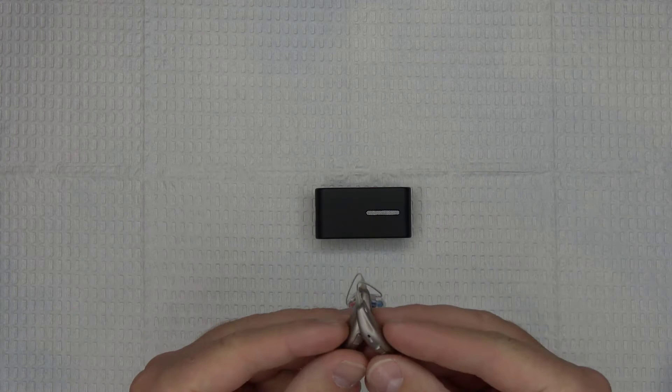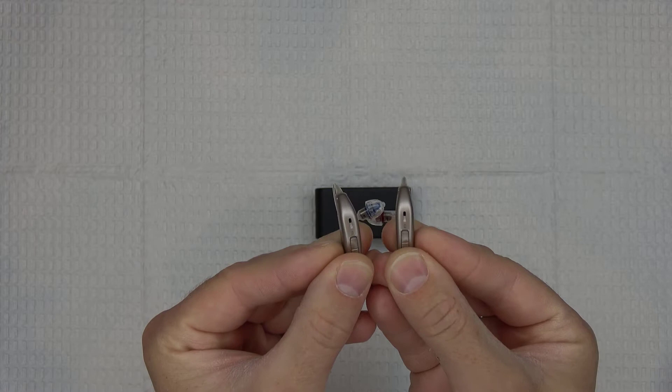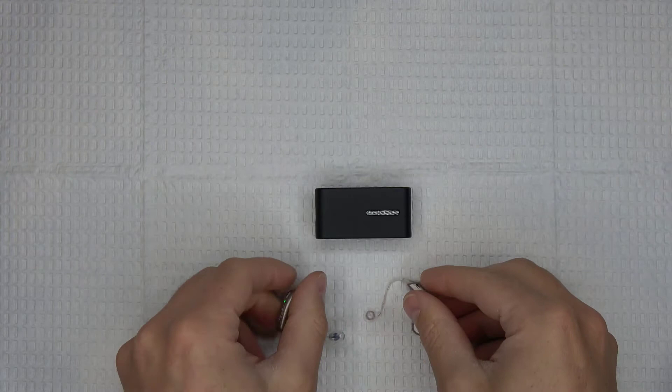Now before we can use any of the features of the Connect Clip, we first need to wirelessly connect it to your hearing aids. To do this, start by turning your hearing aids off and ensure that the Connect Clip is also turned off. For devices using disposable batteries, simply open and close the battery door. For rechargeable devices, either press and hold the volume down button or the bottom rocker switch until you see a red or orange indicator light on the hearing aids. Next, turn your hearing aids back on. Every time you turn your hearing aids on, it puts them into pairing mode for about 3 minutes, meaning that we have 3 minutes to complete the Connect Clip pairing process.